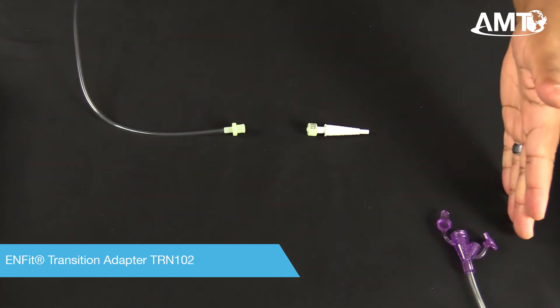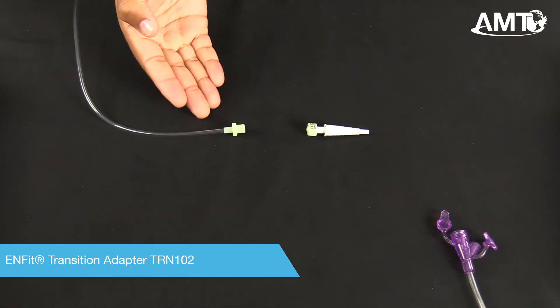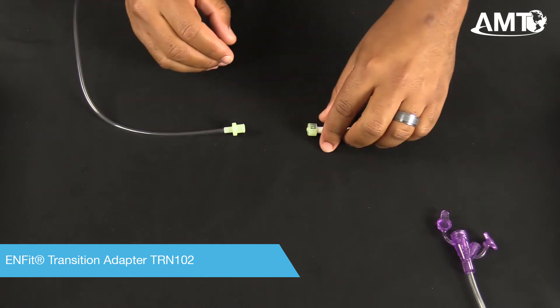If you have a legacy feed set but an InFit administration set, simply attach TRN-102.